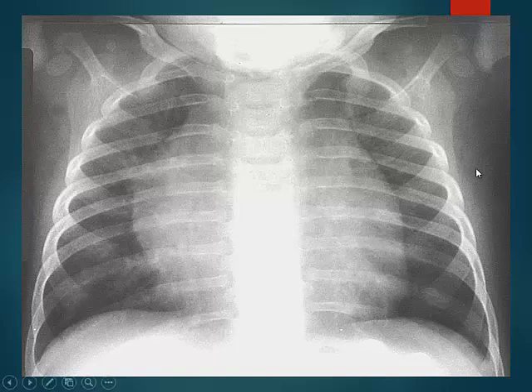Okay, so this is a normal X-ray of a neonate. It is normal because, first of all, it's in a supine position, so there is a lot of magnification of the heart. Also, neonates and infants have a large thymus. So in a neonatal or infant age group, you can have a very wide looking heart and mediastinum, but it's normal.